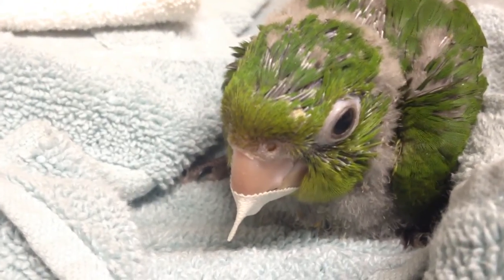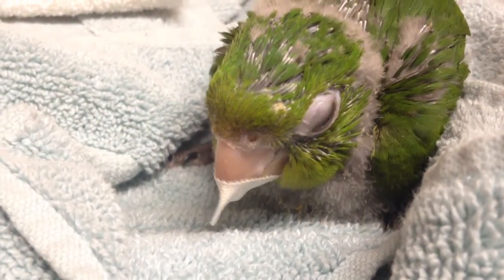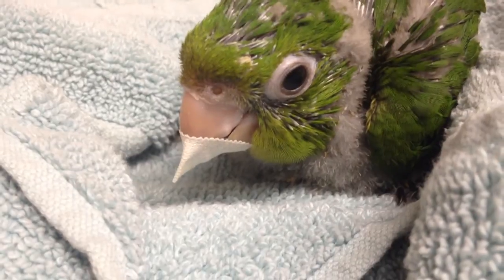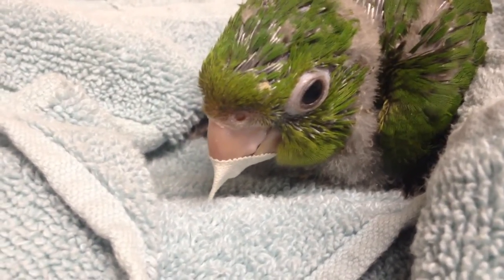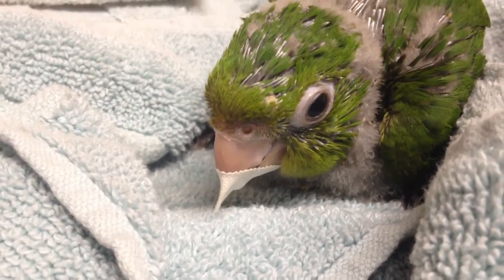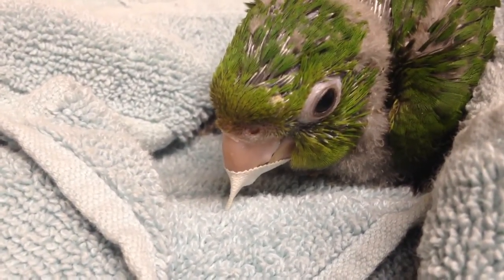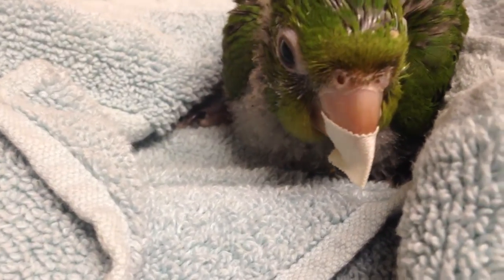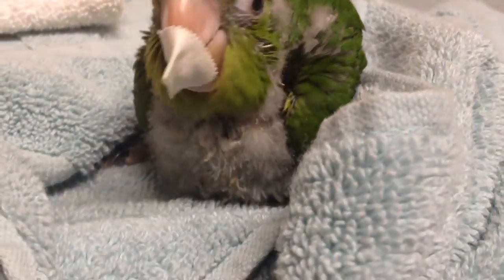In theory, what's happening is while this is going on, the pressure from the upper beak is making the bottom beak curl in more, and the pressure from the bottom beak is actually pushing the upper beak out more. And if we do this for a few hours a day - two or three hours on, an hour off, two or three hours on - they may be able to completely forego any surgery. This is kind of an experiment. This bird is young enough to where this actually just might work.